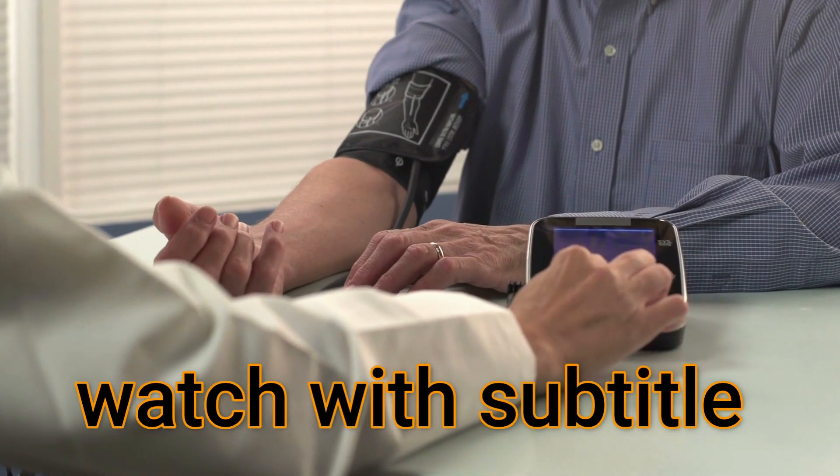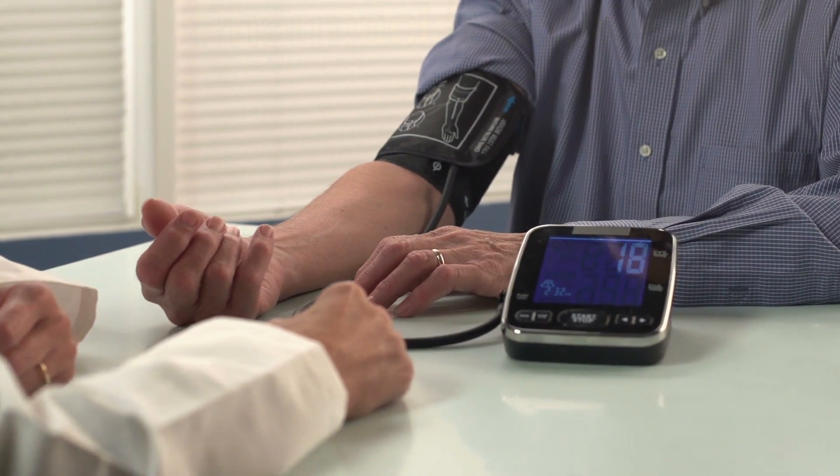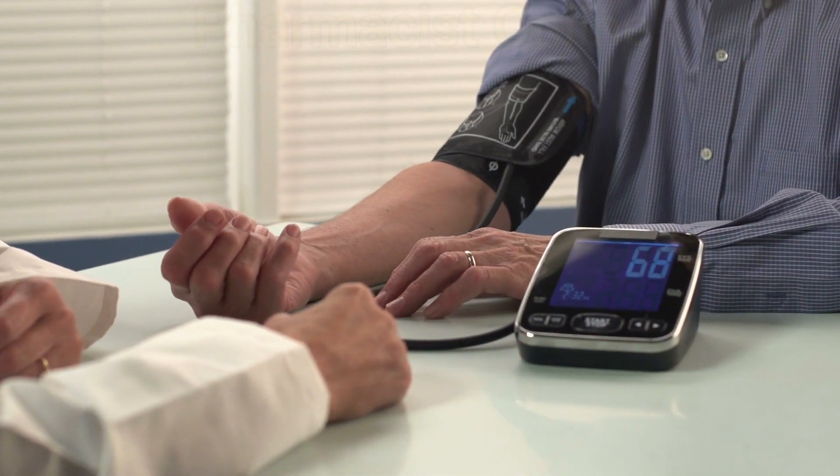Checking your blood pressure at home is very important in the management of hypertension. You can easily check your blood pressure with a digital BP monitor at home.